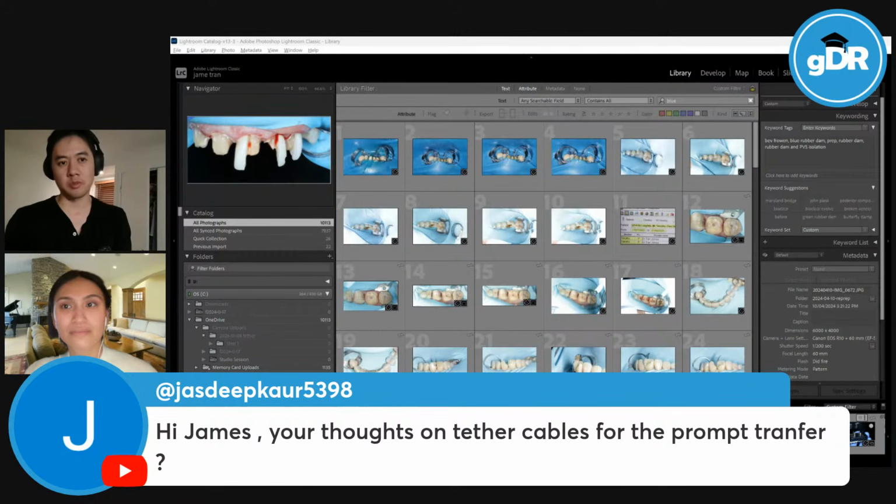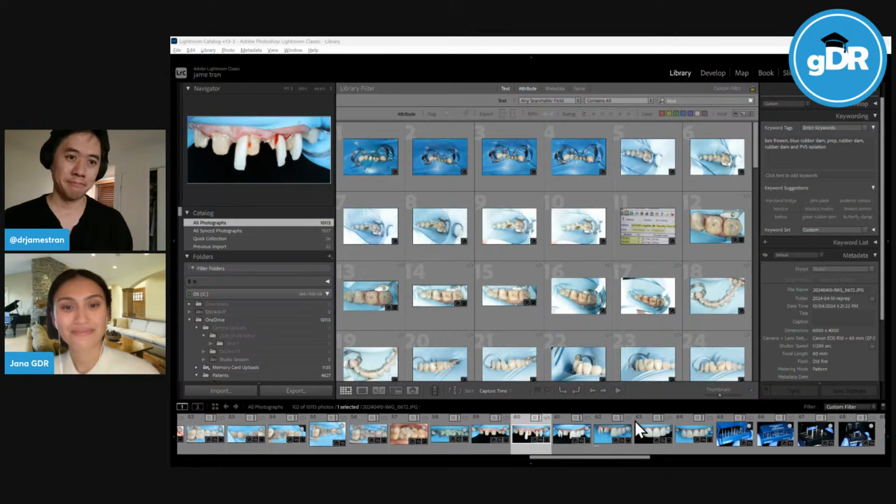I'm still testing it out myself, but I'm still relying on the quick photos. Bang, get my SD card out, put it into the SD card reader and into my computer. Or train your DA, and if the DA is trained, they can do that while you are doing notes or talking to the patients.